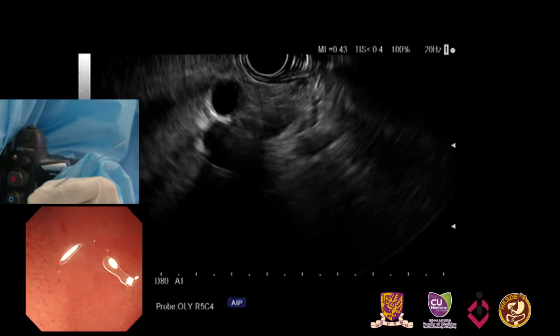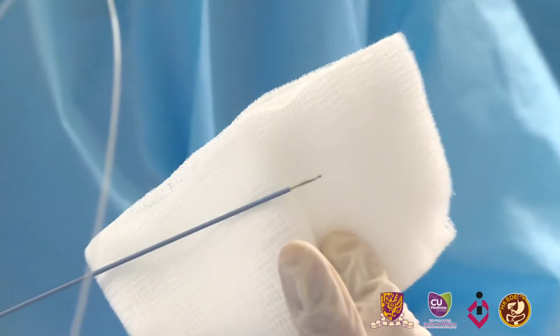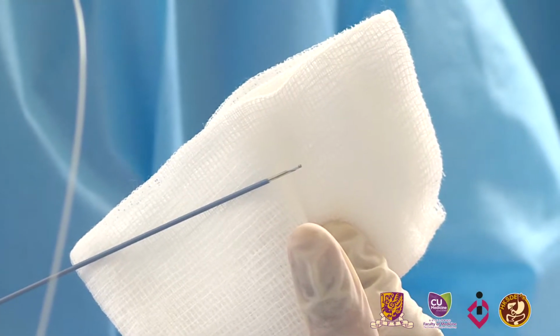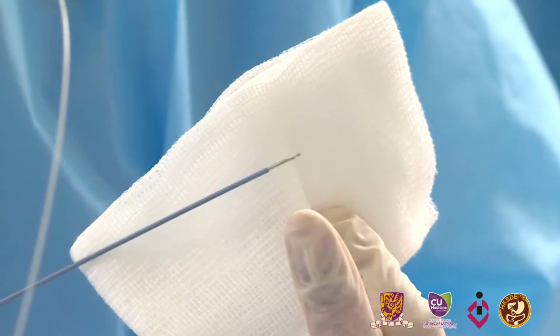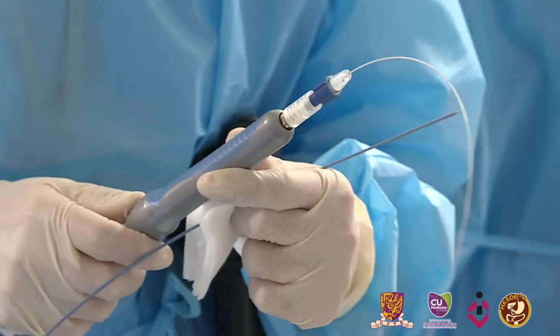We are trying to show the confocal endomicroscope. It's already inserted inside a 19-gauge needle. Can you see the tip? If you can zoom in on the tip. So this probe is 0.85 millimeters, and it goes through a 19-gauge needle. We preload it into the needle, and then it should just extend a few millimeters, because it can easily get broken.